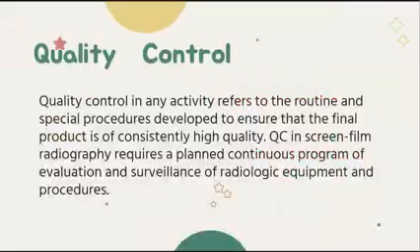So for the quality control in any activity, quality control refers to the routine and special procedures developed to ensure that the final product is of consistently high quality. Okay? QC in screen film radiography requires a planned, continuous program of evaluation and surveillance of radiologic equipment and procedures.